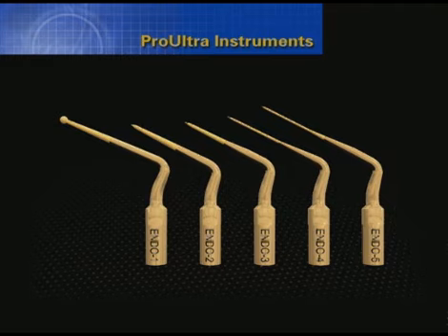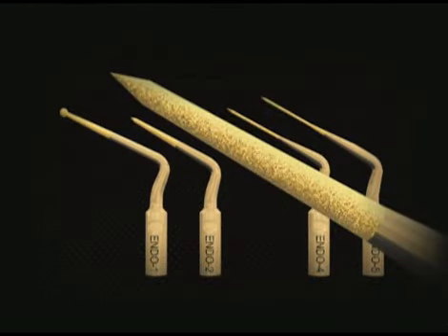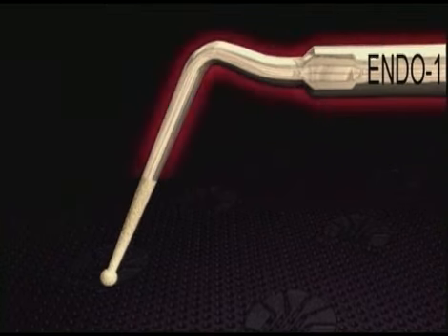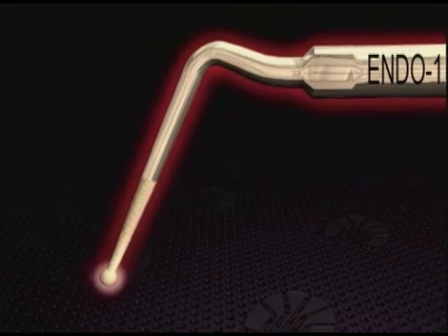These ultrasonic instruments can be introduced into small spaces while enhancing vision, improving performance, and expanding clinical possibility. The zirconium nitride coating enhances durability and enables the instruments to sand away materials during endodontic treatment and disassembly procedures. Because of its superb energy transfer, the Endo 1 will frequently dislodge most posts. This ultrasonic instrument has a ball at its working end, which, when kept in intimate contact with a post, maximizes energy transfer and promotes cement bond failure.